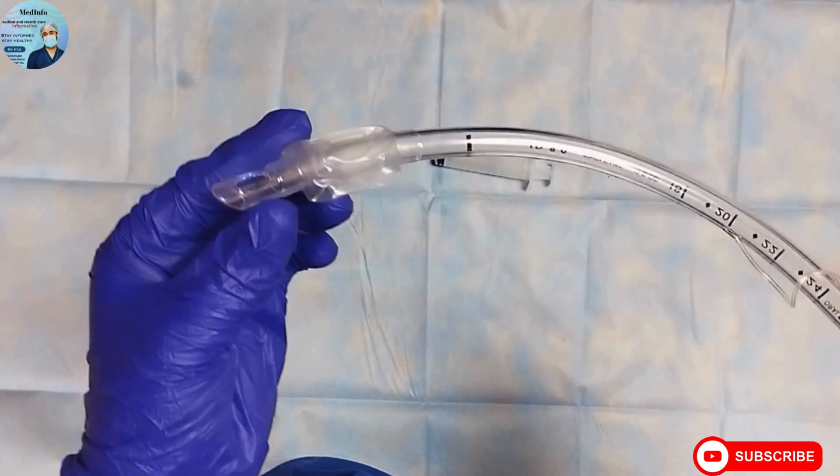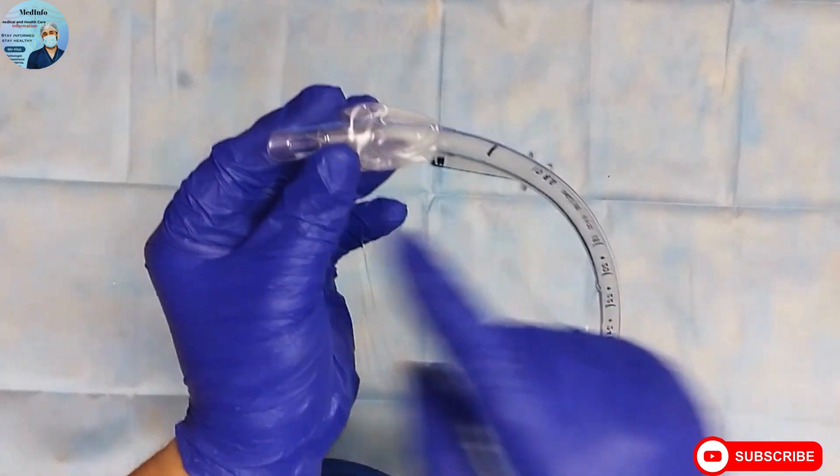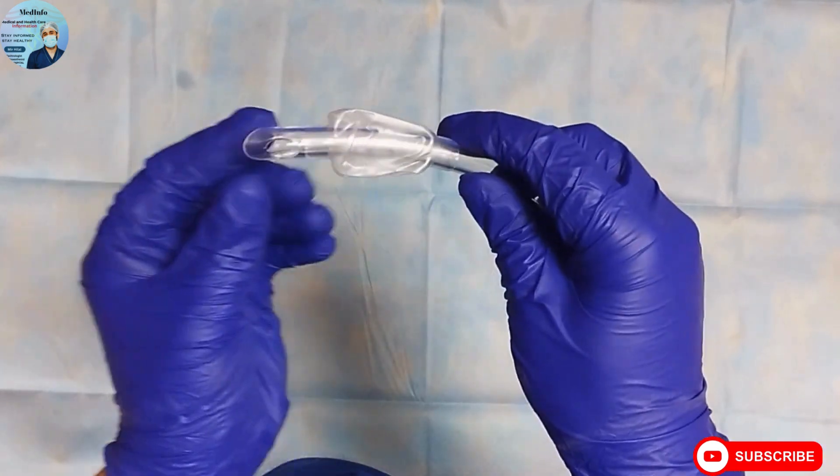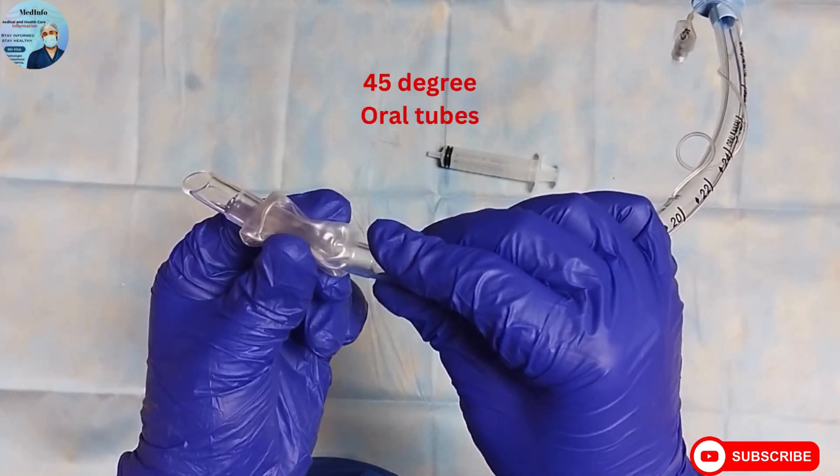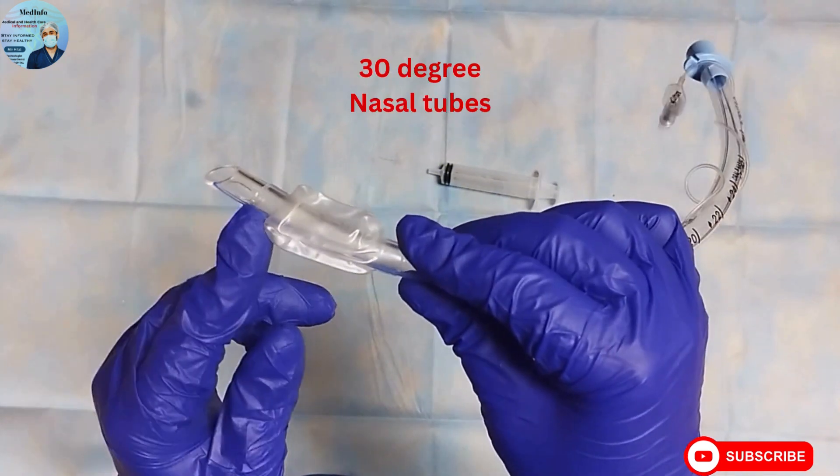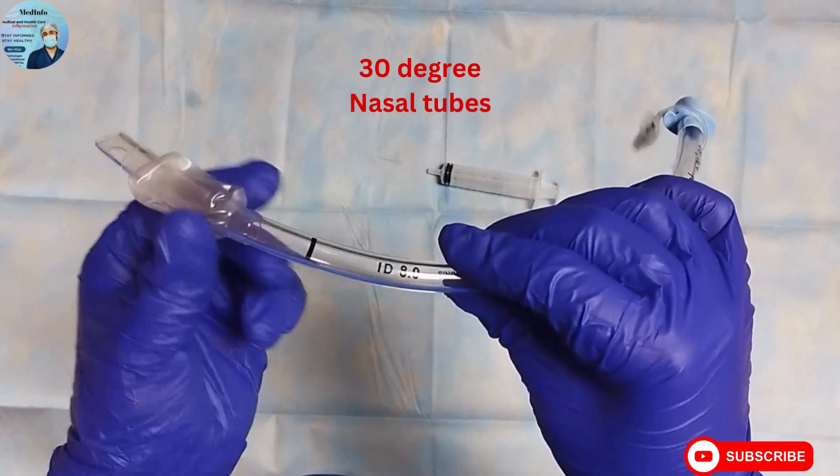This patient end is beveled at 45 degrees in oral tubes and at 30 degrees in nasal tubes. Now, while deciding the length of endotracheal tube, optimal length is the length at which air entry is equal to both sides of the chest.